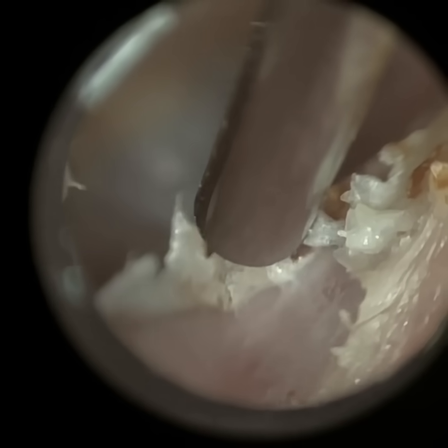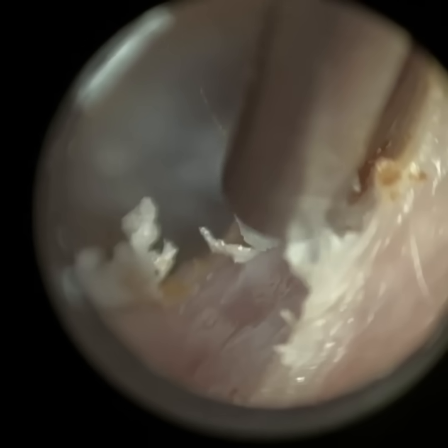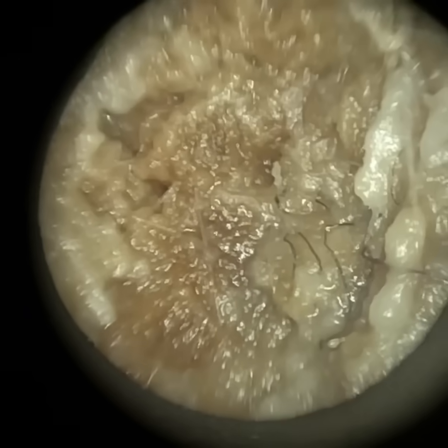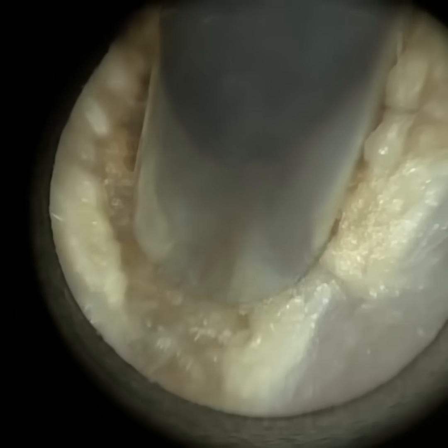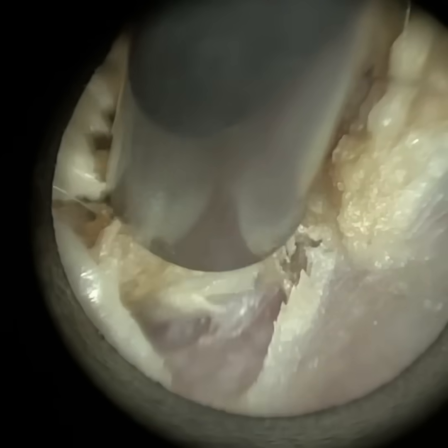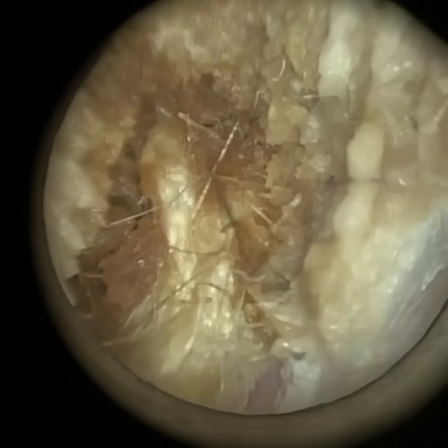I'm going to see if this skin peels away — I'm not sure it does, so I'll just leave it there. There's just a little bit more there; you can see the precision we can work with using this magnification. We're now moving on to the left ear — the ear that's more sensitive. Going to go inferiorly and try to lift this off the bottom. It just has this fungal appearance, this debris — it seems a bit woolly.